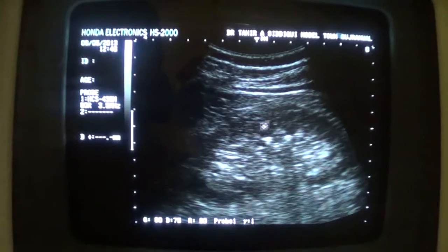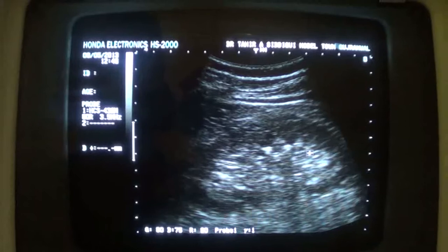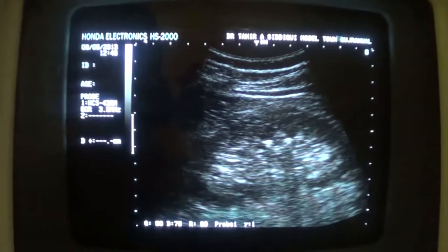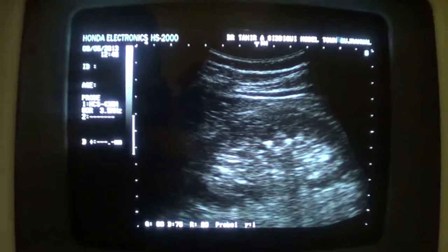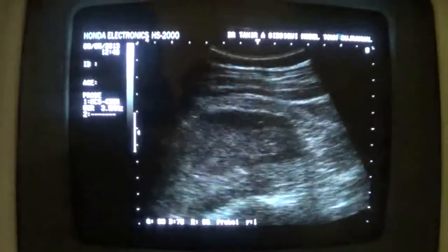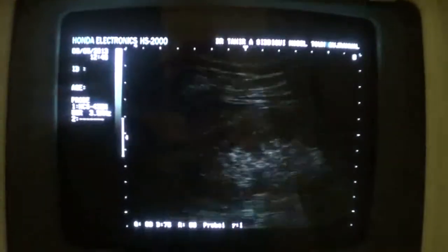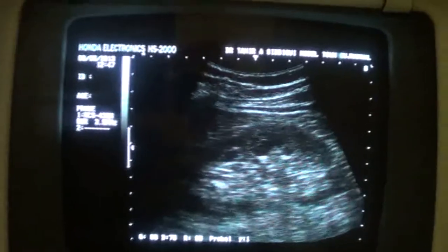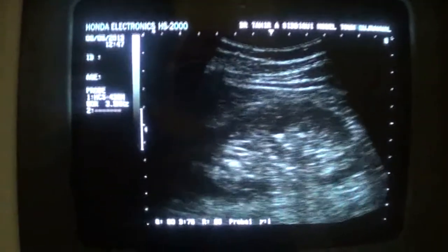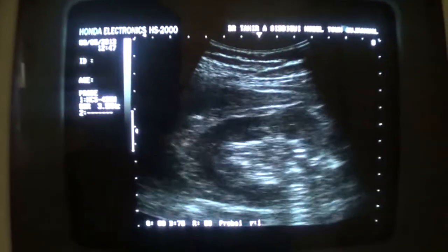This is the renal pyramid, this is the renal pyramid, and you can see in this case there is muffling of the central sinus echo complex. The fat that is present over here is showing muffled. So this is a case of medullary sponge kidney unless proven otherwise. So these echogenicities should not be confused with arcuate vessels.